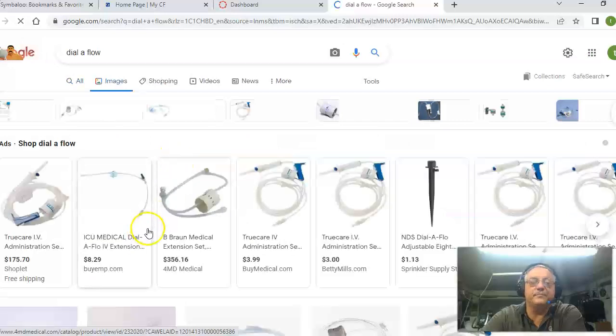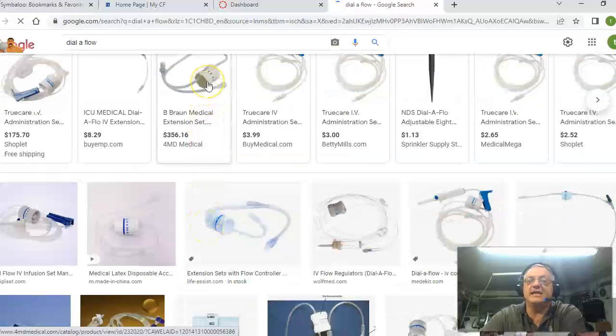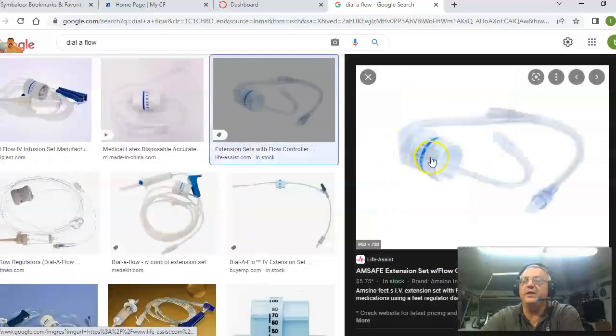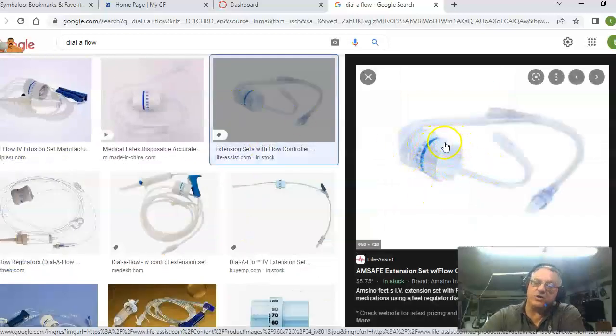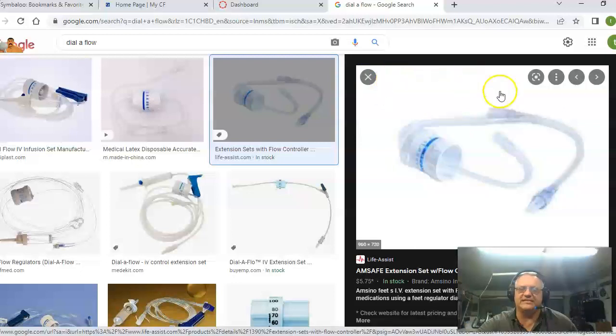All right. So dial-a-flow, guys, allows us to control the flow rate. It's an extension tubing with flow control to it. So you can actually dial what rate you want. The problem is they are not exactly perfect. They work good for certain situations, but I would not use this on a medicated IV in which I needed precise control.